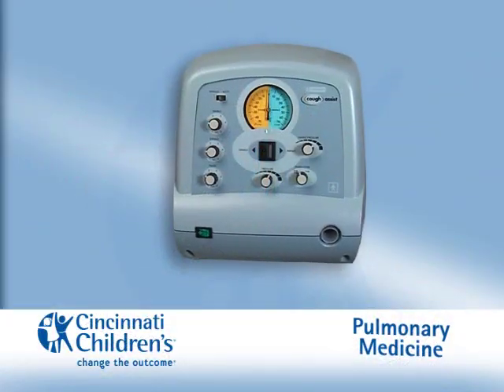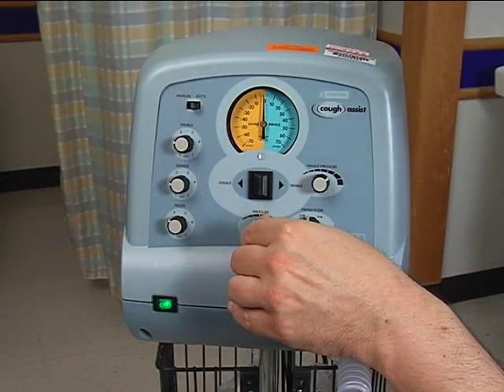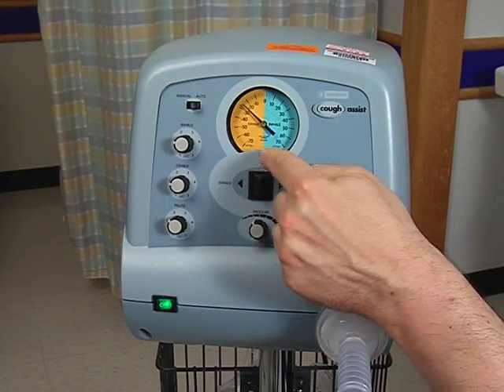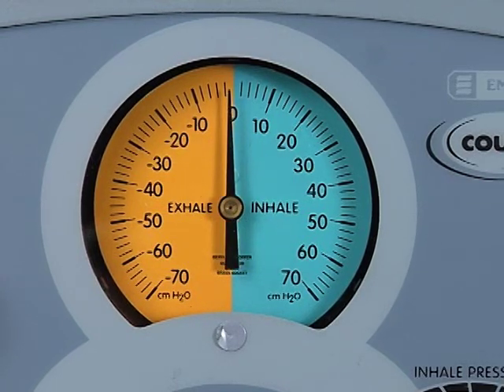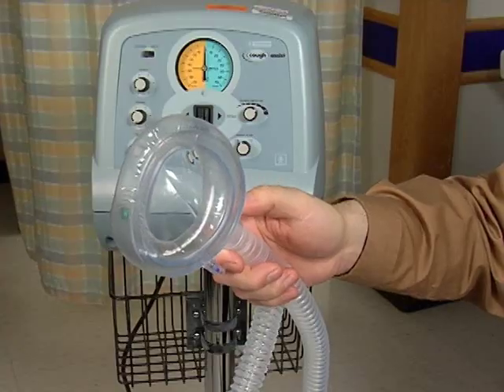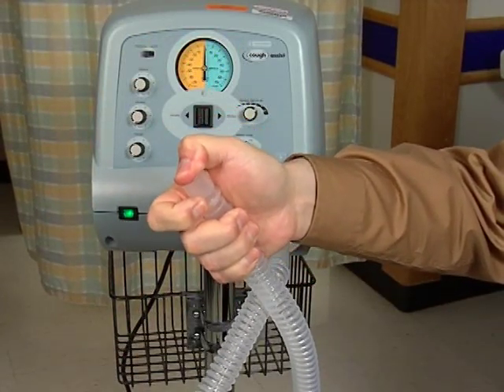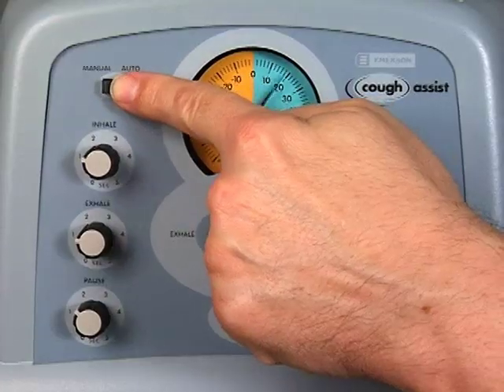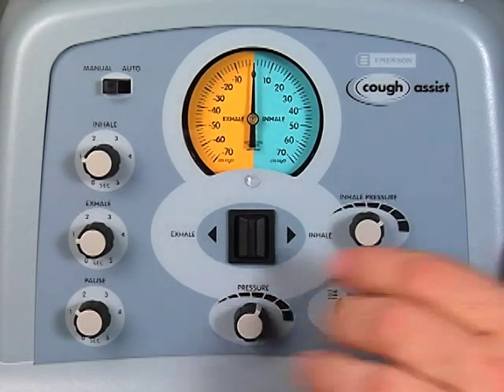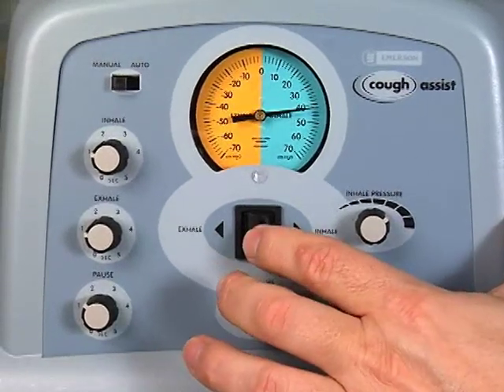How do I use the Cough Assist Machine? Check to make sure that the inspiratory, or positive, and the expiratory, or negative, pressures are set. Start at plus 20, minus 20, and you will increase to maximal pressures by increments of 5 cm H2O as tolerated. Remove the face mask or mouthpiece and hold the tubing firmly against a tight surface. Set the manual/auto switch to manual. Toggle the manual control switch between inhale and exhale a few times to ensure that the pressures are correct and the manometer returns to zero.